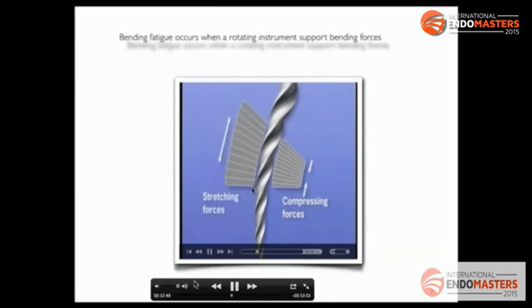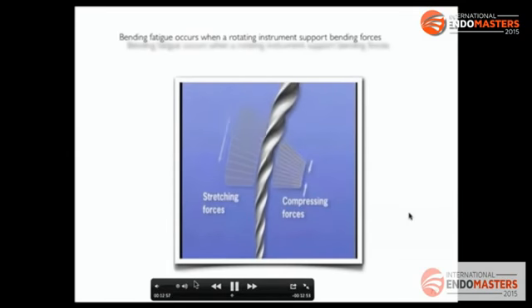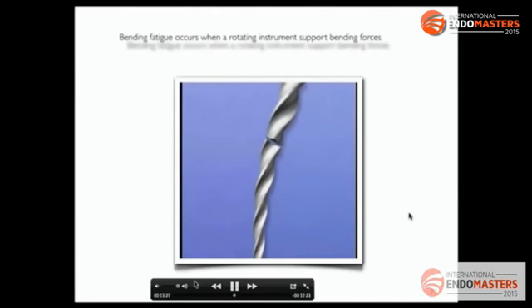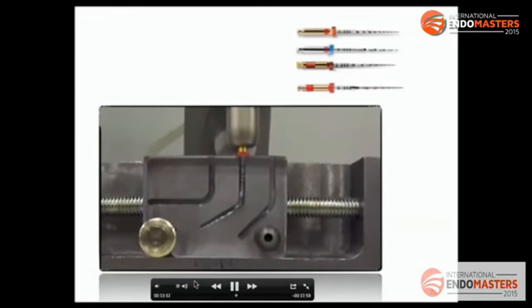Here we can see the flexional test. Flexional fractures are produced when we are in rotation with a file in a curve. The inside of the curve is under compression, and the exterior part of the file is in elongation. This goes at 300 rounds per minute, and this is going to create a break in the file. This is important because when we place a file in a canal working at working length and we don't move the file, it is going to be curved at the same point. So at this maximum point of curvature, the file is going to suffer a lot of flexional stress, and the file can break from flexional or cyclic fatigue.